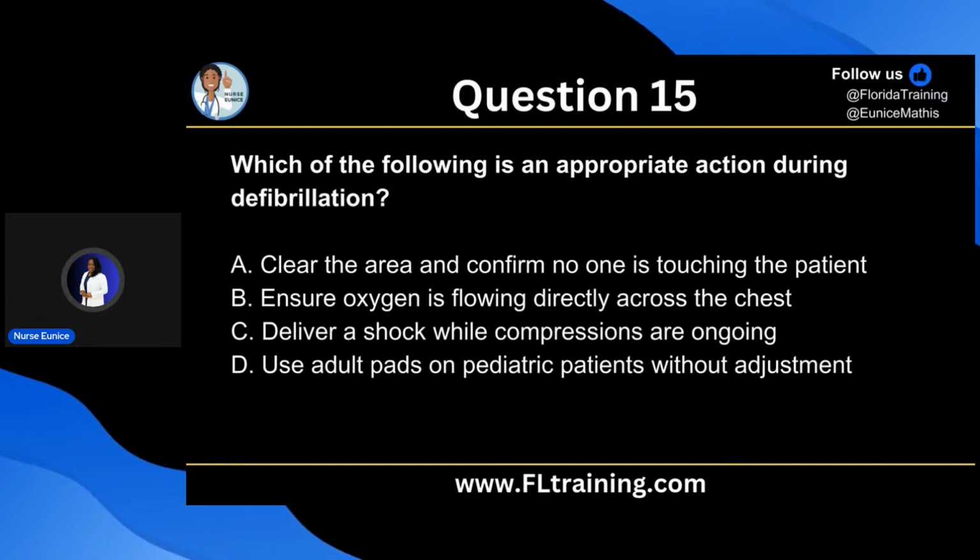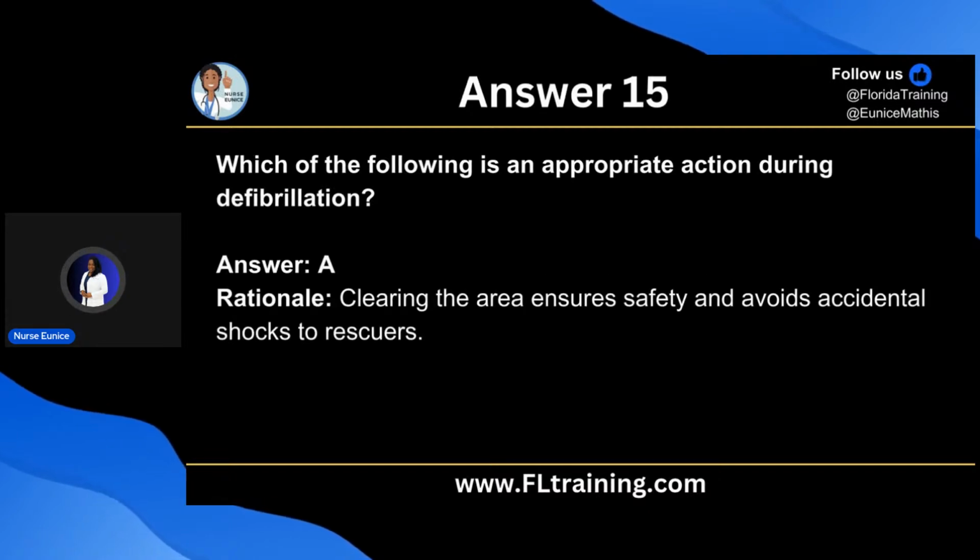Right, and everyone should get this right because we are safe caregivers. The correct answer is A. We're going to make sure that we clear the area to make sure that we do not shock anyone else.